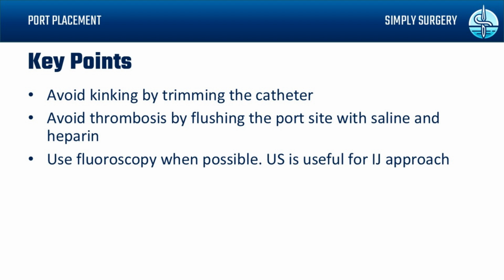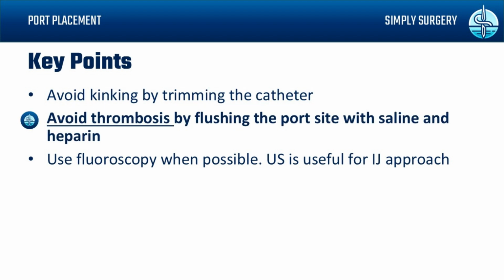Is there anything else that maybe we've touched on briefly that we should really refocus on here? So yeah, just to reiterate, to avoid kinking, you want to make sure that you don't have too long of a catheter inside that port pocket. You want just enough to reach the port and nothing else. Finally, to avoid thrombosis, patients need to flush their ports often. This is generally done with a mixture of saline and heparin.